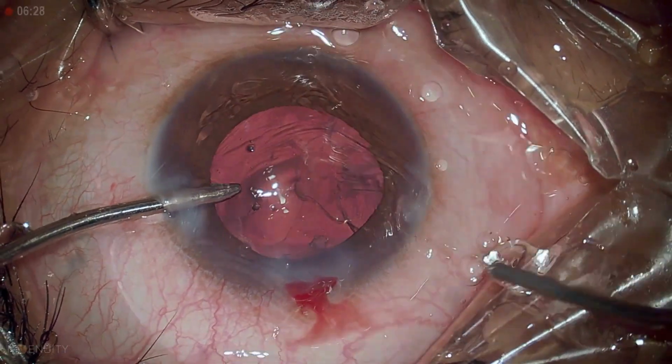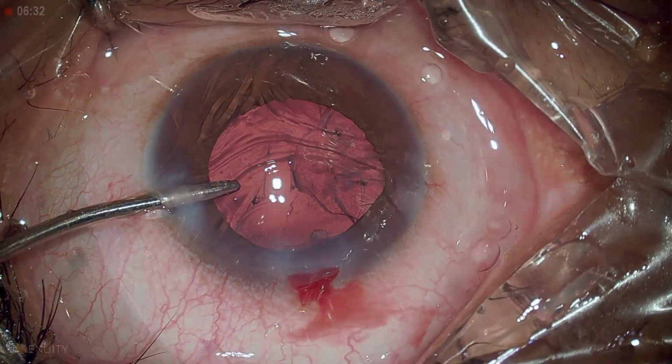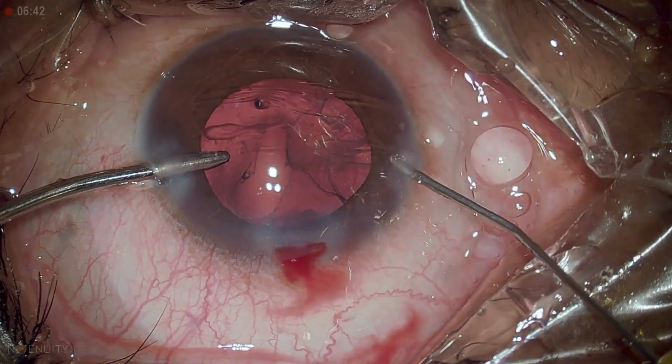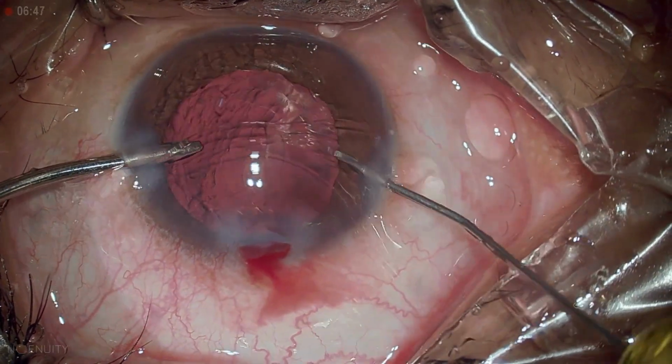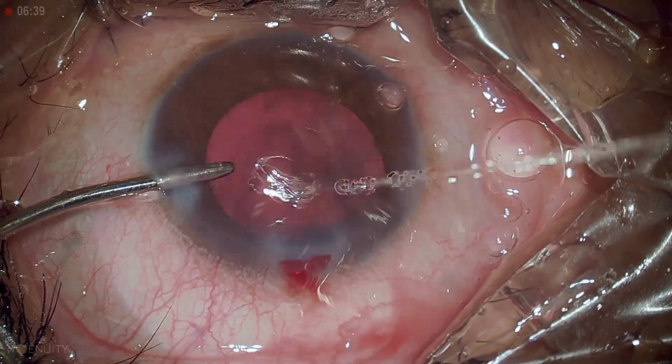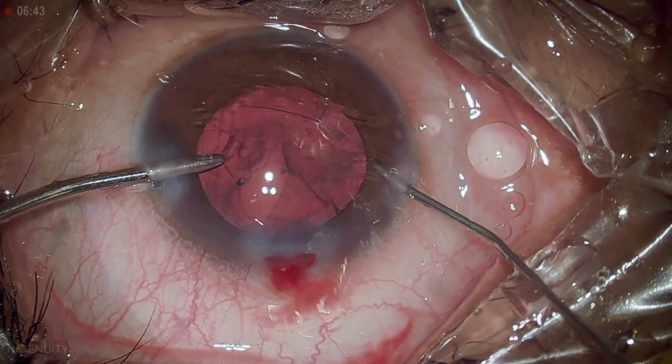The high viscosity silicone oil is floating in the conjunctival cul-de-sac. The moment you put Viscoat in the chamber, that also is good enough to tamponade the silicone oil.